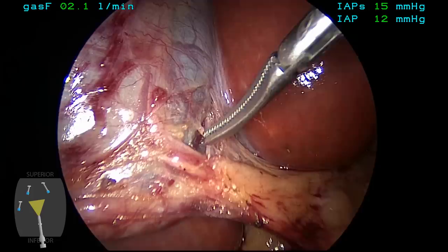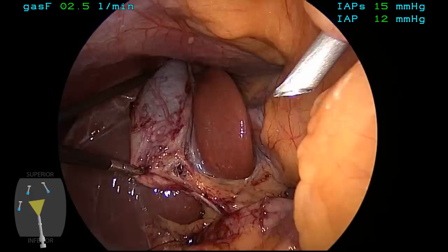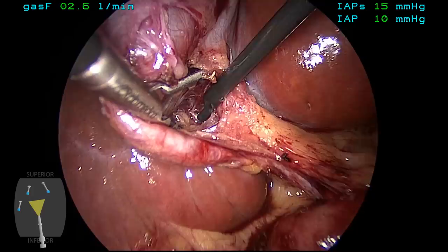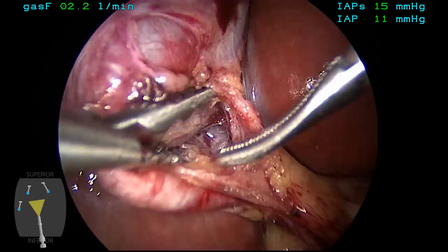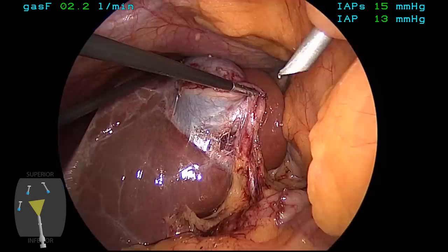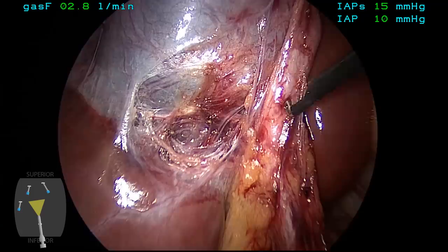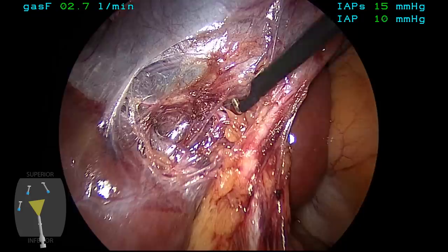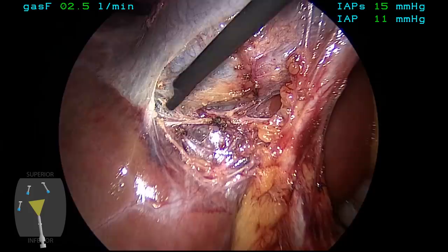At this point, a blunt Maryland-type dissector is used to gently spread and to open up the tissue planes in the hepatocystic triangle both above the cystic artery and in between the cystic artery and cystic duct. The remaining connective tissue attachments and small vessels are then divided with the L-hook monopolar device. One can now see a nice window between the cystic duct and the cystic artery, and we further complete this by blunt dissection. The neck of the gallbladder is retracted medially again and peritoneal attachments are divided with short bursts of energy to completely open up the hepatocystic triangle and to fully expose the cystic duct and the cystic artery.